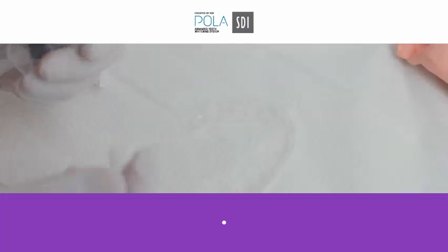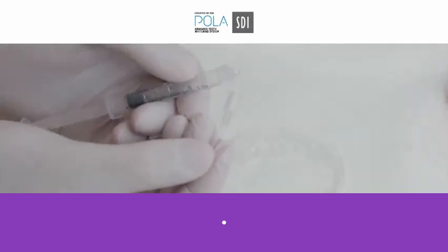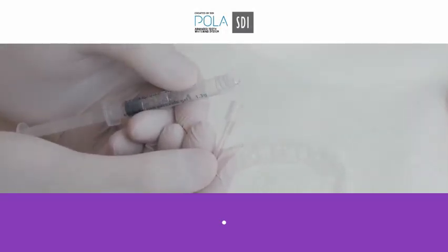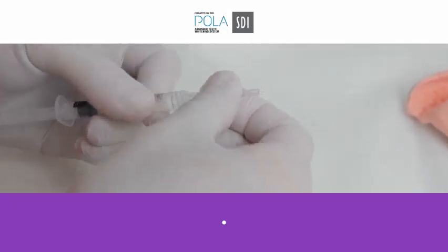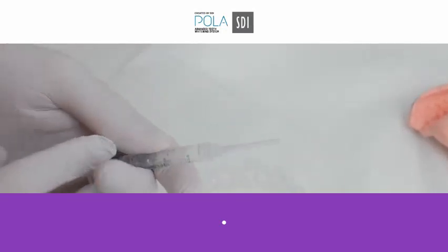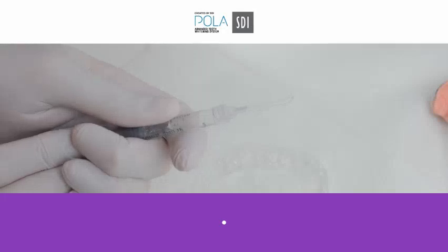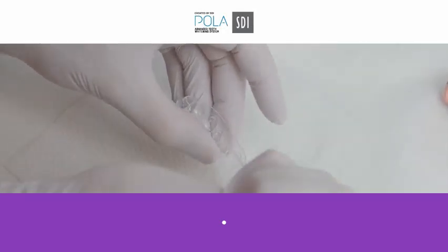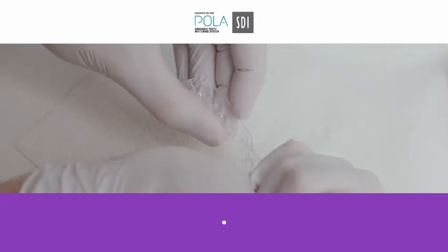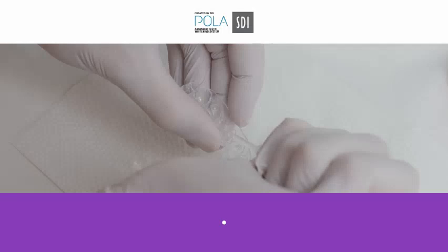Something that I always discuss with my patients is putting the little cap on, because when they're in the surgery, they often forget what you've said. So you make sure that they know you've got a little cap, you pop it on, and you turn it round. Make sure you depress the plunger a little bit, and you'll see it come through. Show them exactly how much whitening gel they need to whiten their teeth. So a little blob in there, about 2 mils. And make sure that they can do it.